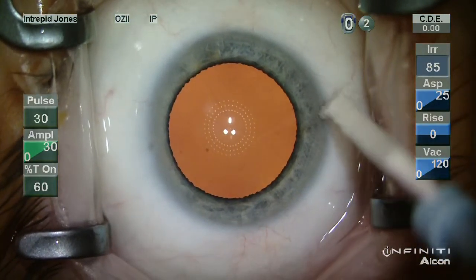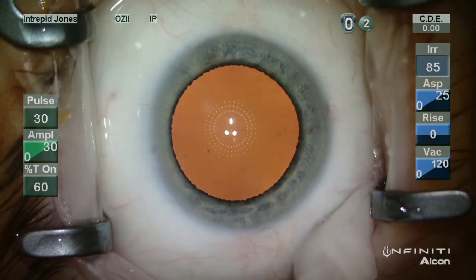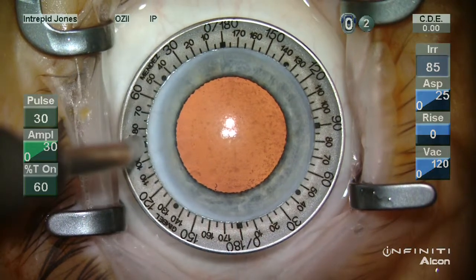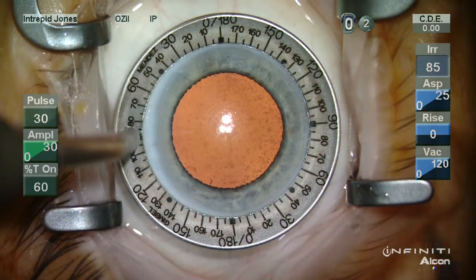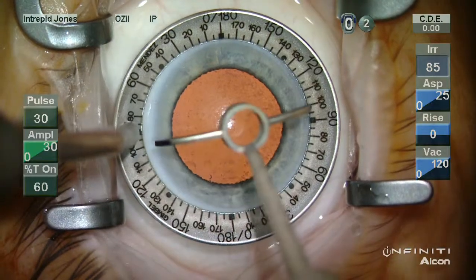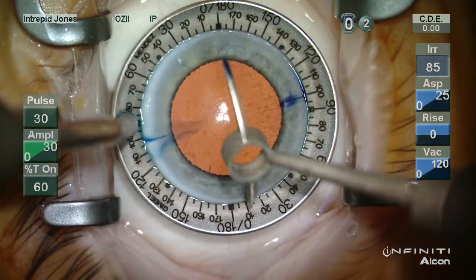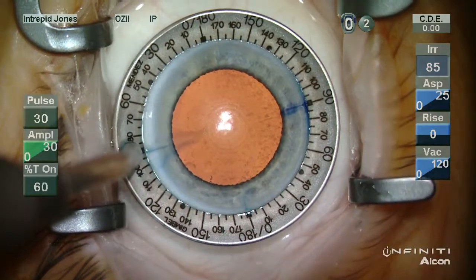So once again, we reveal the marks made by reference at the slit lamp, and we dry the fornices. This is very important. You want to make sure you have a dry fornix, as the ring will imbibe fluid and then obscure your marks at the limbus as well as the marks that you create. This is a 2-ray marker, and I'll be placing this relaxing incision at 100 degrees. So I like to touch down on one side and then orient myself to the opposite. Once again, we'll place a mark for the main wound.